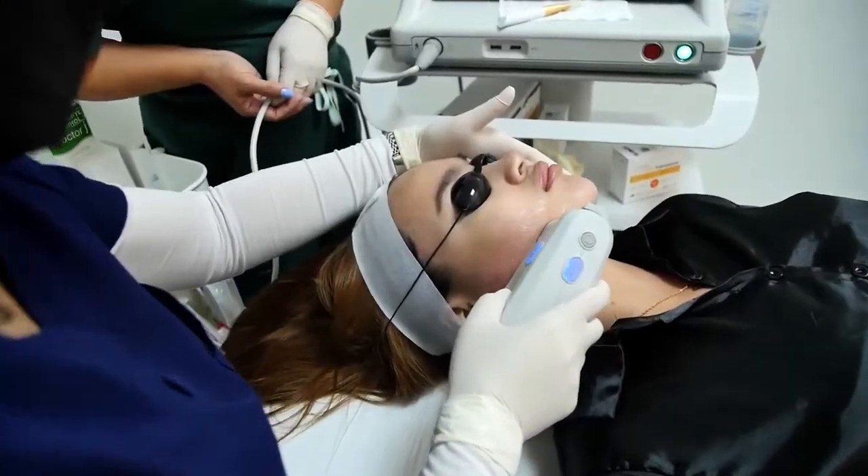I love this because it gives an instant analgesic effect before any cosmetic procedure. Our patients appreciate it because it really reduces pain or any discomfort. And if you are in a hurry, you can instantly spray it and seconds only, it's going to take effect and the patients won't feel the pain from any injections or even laser or energy-based devices.